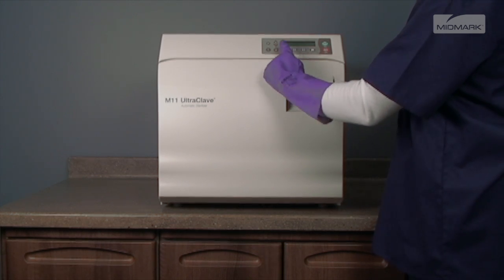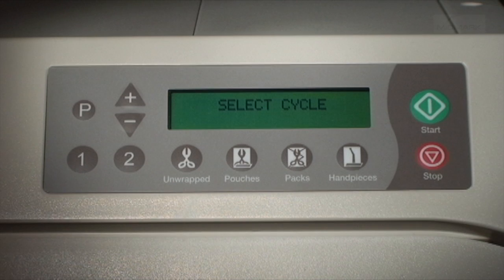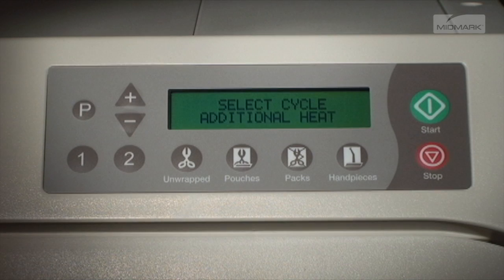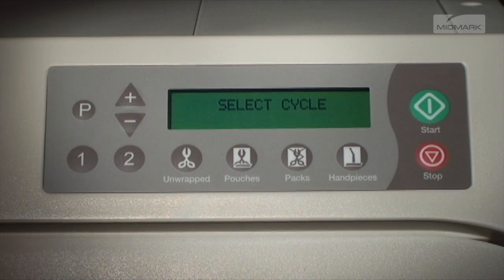The display will show Select Cycle and waits for input from the operator. If the Start button is pressed, additional heat is shown on the display. This allows the operator to either preheat the unit or extend the drying time on the previous cycle. Pressing the Stop button will end the additional heat time.